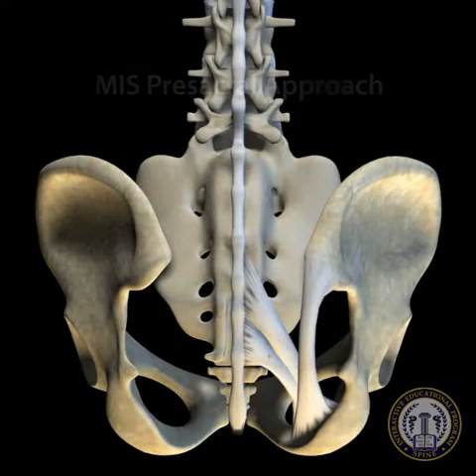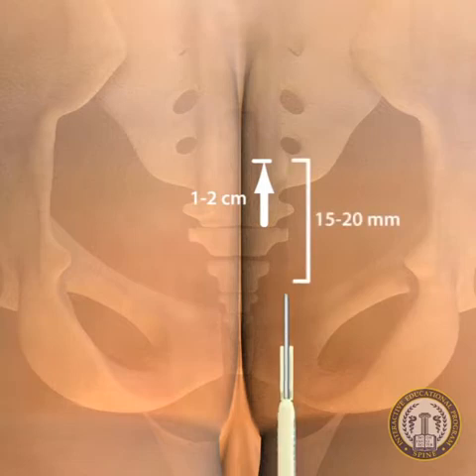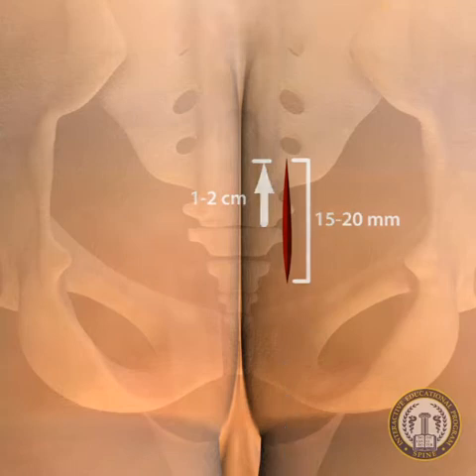It is advantageous to have biplanar fluoroscopy throughout this procedure. The surgeon should palpate the coccyx and sacrotuberous ligament arch. Beginning 1 to 2 centimeters caudal to the paracoccygeal notch, a 15 to 20 millimeter paramedian skin incision is then made and carried through the superficial fascia.